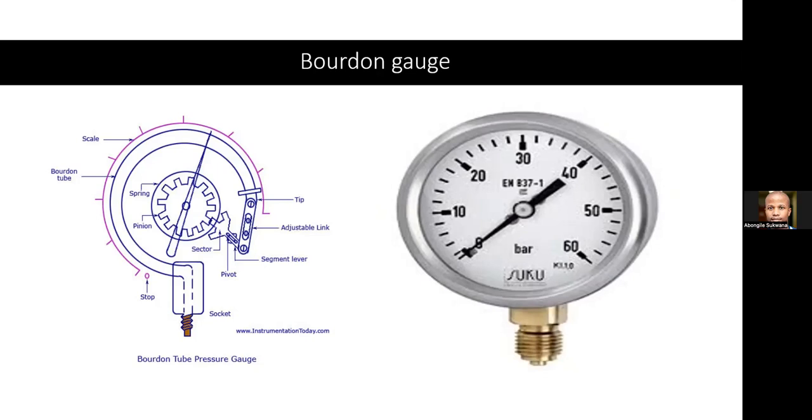The reason it's not reliable is because in the cylinder, nitrous exists in both liquid form and gaseous form. The reason for this is because nitrous oxide evaporates at room temperature.